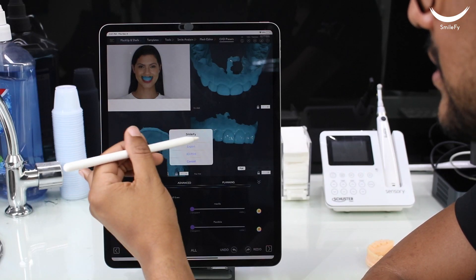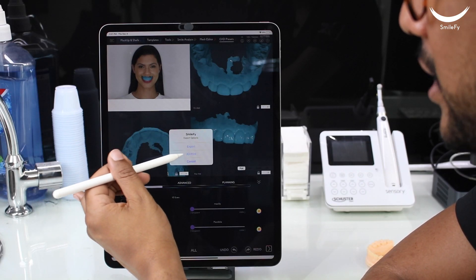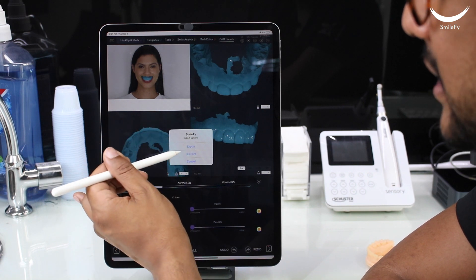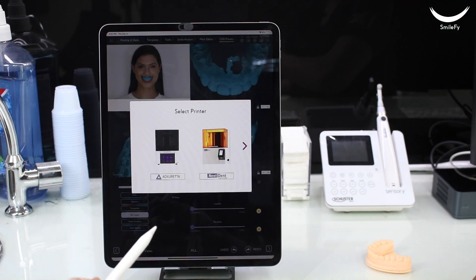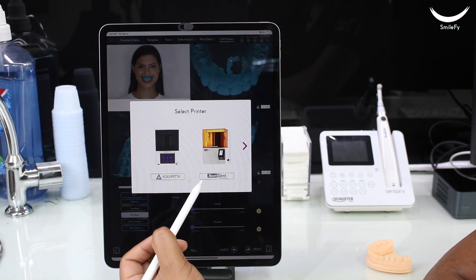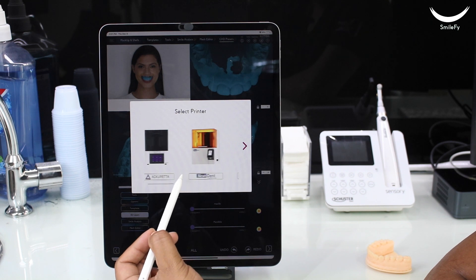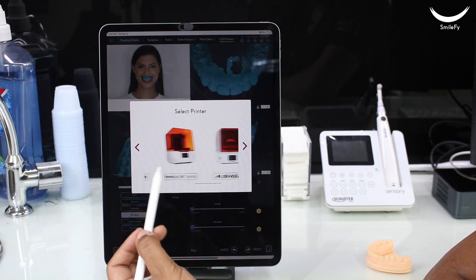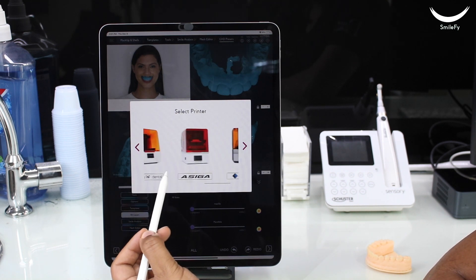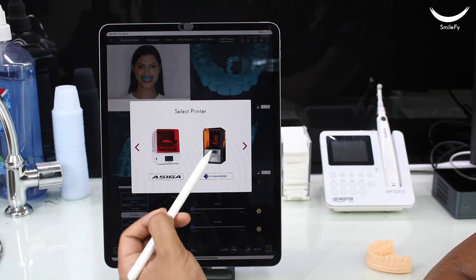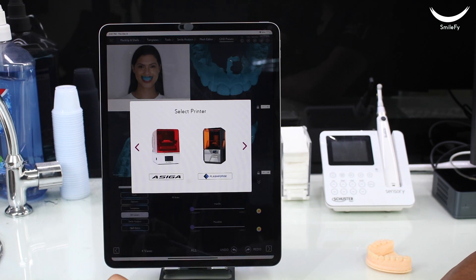Once the files are ready to be exported — which takes only one minute to create — you can send your 3D file straight to your 3D printer, or export it and send it straight to your lab for them to 3D print the models.